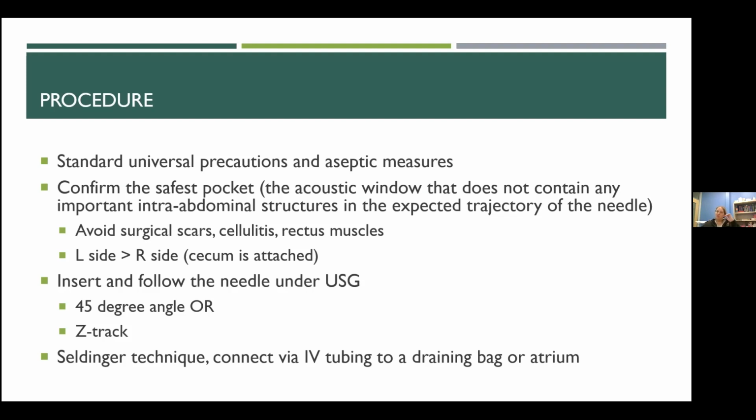Again, you want to try to use your dynamic ultrasound as much as possible. So not just a static mark of where a safe spot is, but really following that needle tip, in the same way as you would for the vascular access we've talked about several times. So following that needle tip, advancing your needle, advancing your probe, advancing your needle, advancing your probe, and just making sure that you are safely moving into that abdominal cavity.